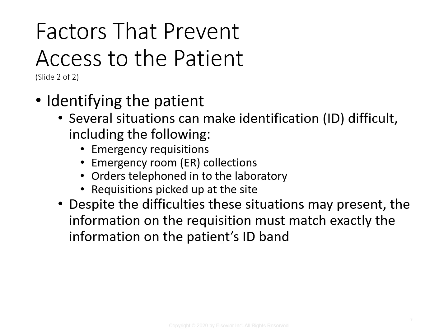Getting orders through the telephone, sometimes we call those verbal orders in the laboratory. We need to make sure we document those if that does happen, and make sure you follow your policies, protocols, and requisitions that are picked up at the site. Sometimes things aren't filled out appropriately. Again, we're all human, things happen, so just make sure we double check everything.